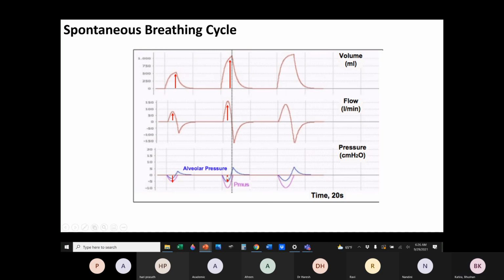Now, if you change the inspiratory time, in the sense you breathe a little longer with the same negative pressure, that means the negative pressure hasn't changed much. Then no matter how much longer you breathe, the tidal volume will be the same. This is important. It will stay in the lung longer. That will of course eventually give you a slightly different kind of gas exchange availability.